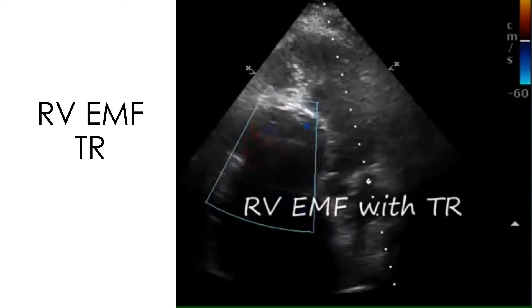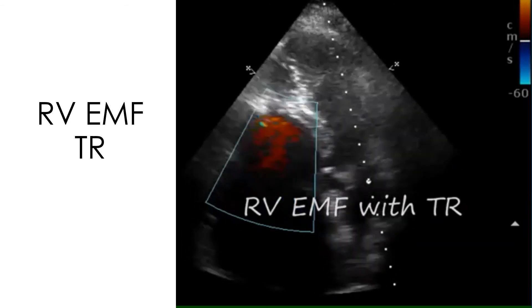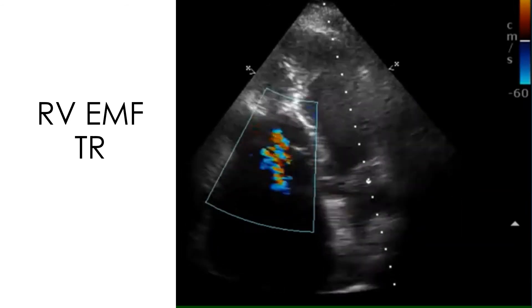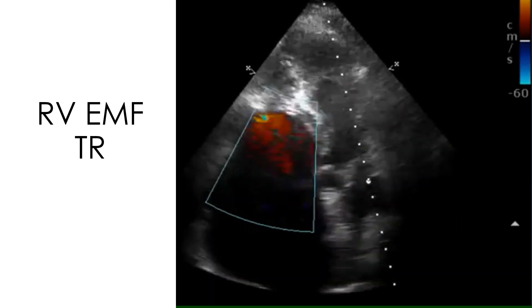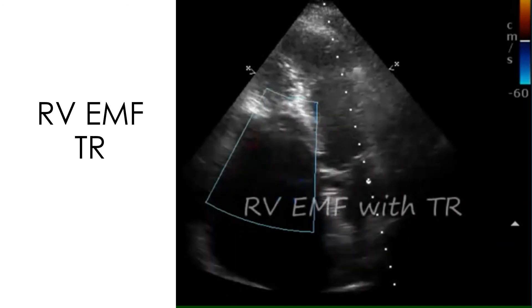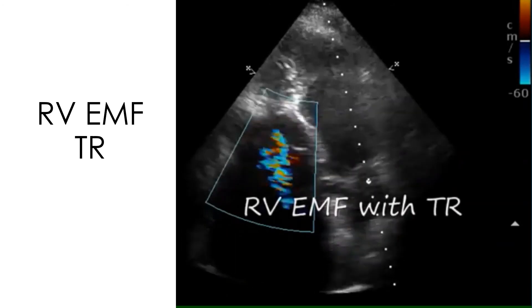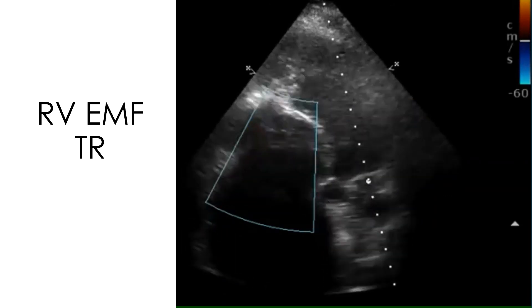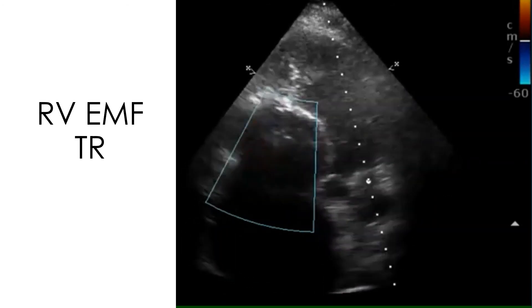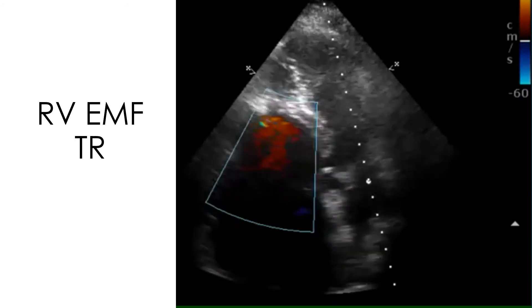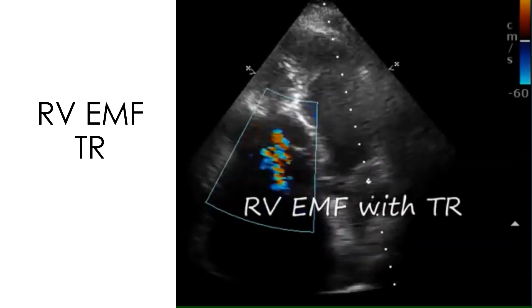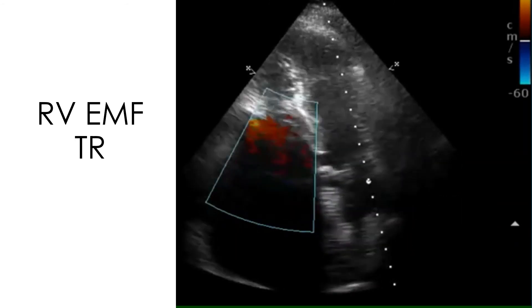See the color bar at the top right corner, which corresponds to a gradient of only 1.44 mmHg. That means aliasing will occur if the gradient is just above 1.44 mmHg.